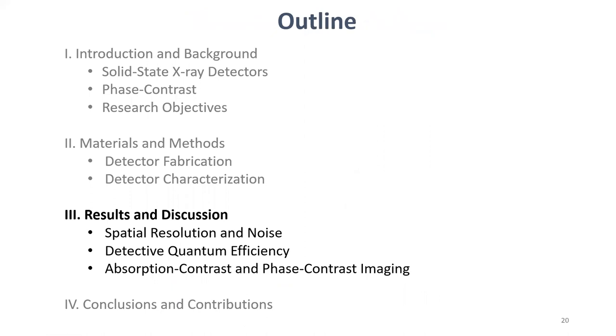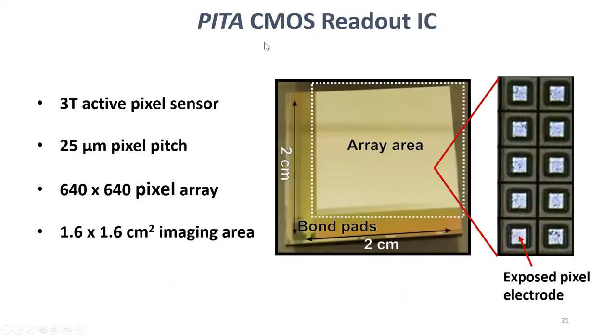All right, so let's talk a little bit about the results. This was one of the early prototypes. It's the first prototype that worked properly, let me put it that way. The earliest prototypes we built were back in 2007, 2008, but they all had a hard time working for a variety of reasons. Either the selenium was crystallized, or the devices were too small to really put selenium on top of them, or the electronics failed because the circuit design wasn't done correctly. There was always some reason, but this was the first one that actually worked. It was done in 2010, 2011, in that time frame.